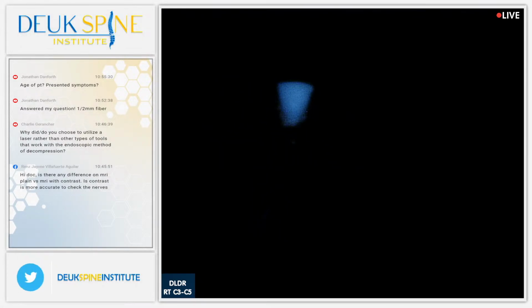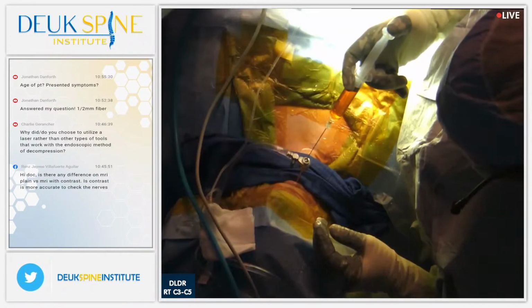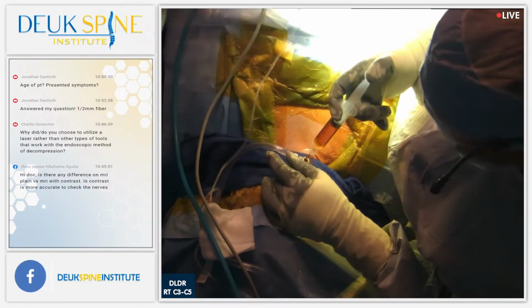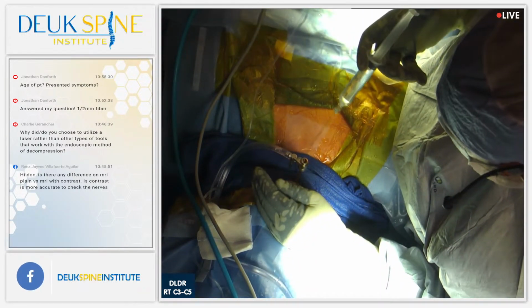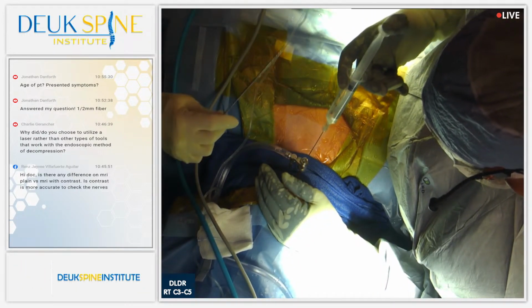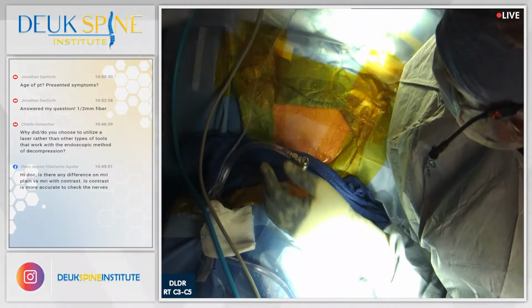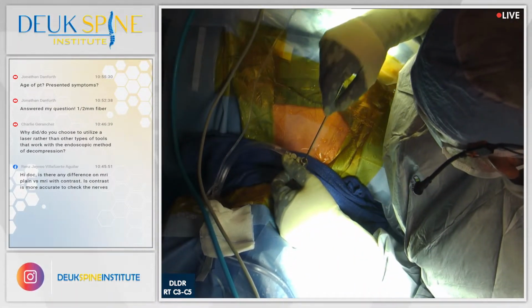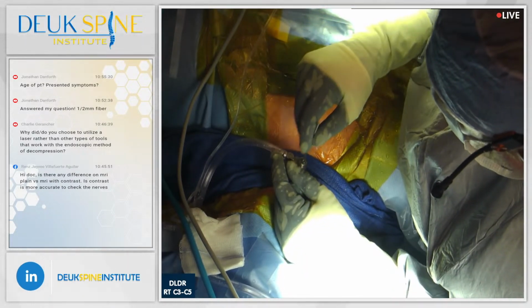0.05 millimeters. That's, take a millimeter, divide it into 20 parts. That's how accurate I am with the fiber laser. There is no surgical tool that comes close. If you have a normal surgical tool that other surgeons use, they can get down to about a millimeter of accuracy. We're 20 times more accurate.